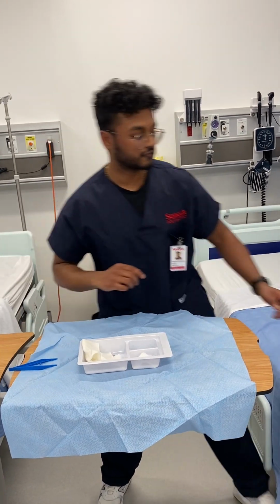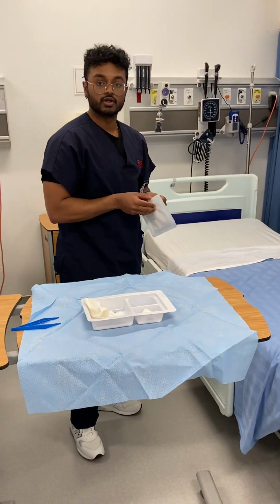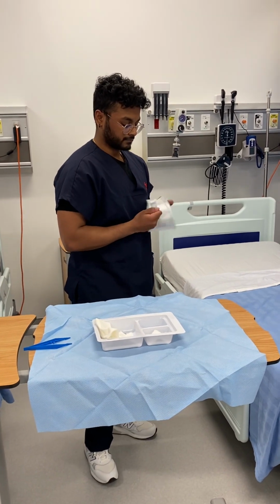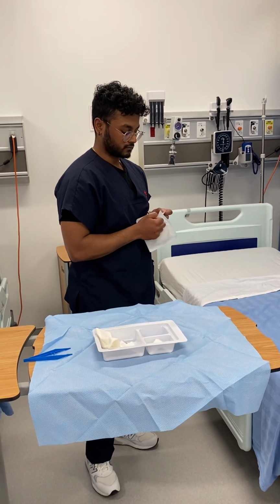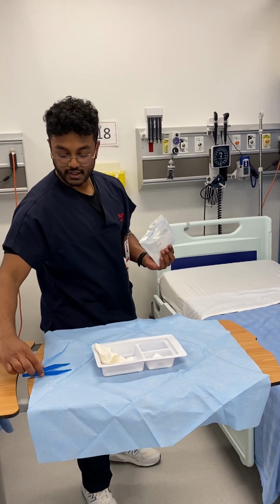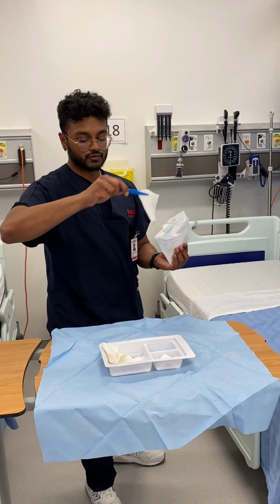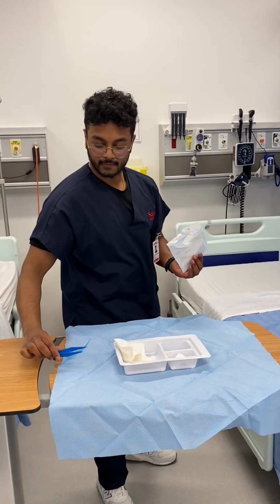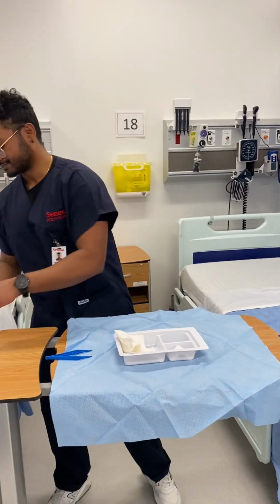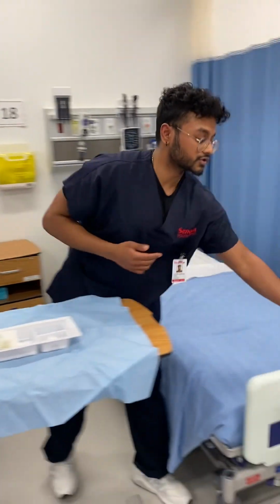Now we'll be adding our 4x4 gauze. So we make sure to peel away from sterility. And in this situation, because it's sterile inside, we'll make sure to grab our forceps, being careful to remove, place within the bin, eliminating this in our waste, as well as our 2x2 gauze.